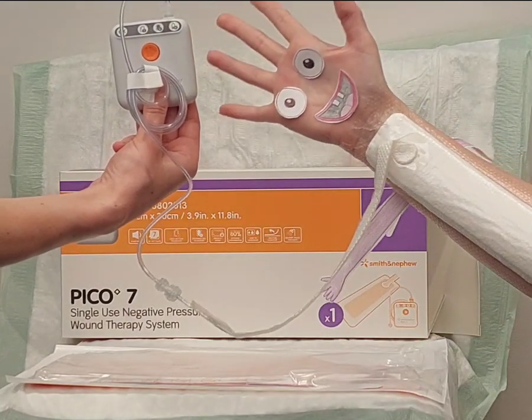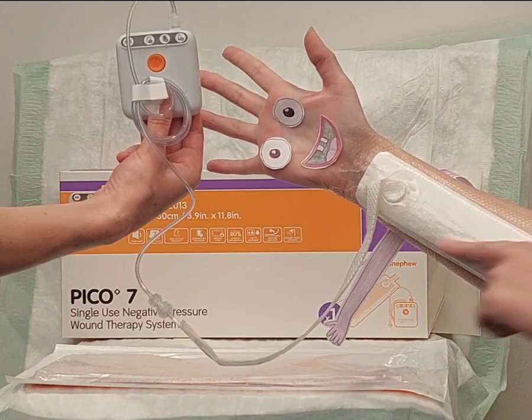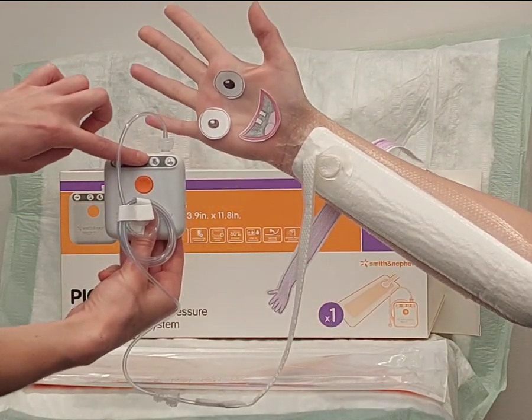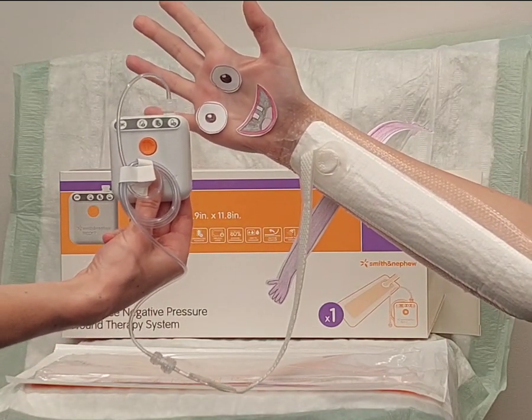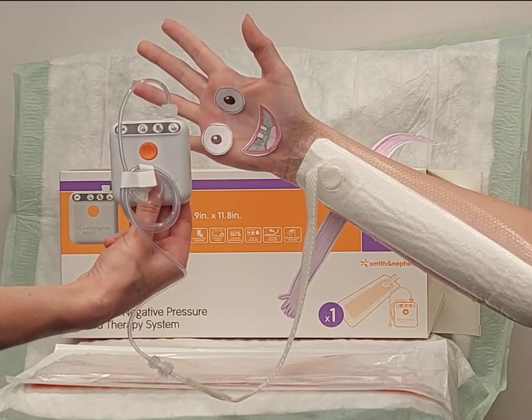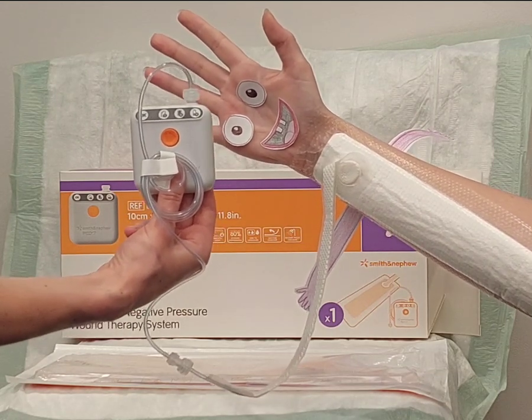Take care not to cover the middle area of the dressing, as this will interfere with its ability to allow moisture to evaporate. If the second light is flashing, the dressing needs checking and may require changing. Dressings can last up to 7 days, but should be changed if the exudate has filled 3/4 of the absorbent pad or is around the port.